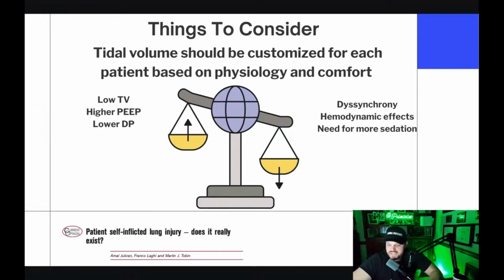Melody always says that, and I agree with the fact that, yeah. So, respirologists, we're going to get to the PRVC. Don't worry, we're going to elucidate that tremendously. I just don't know for me in the hospital how much it's helpful. I can see if you're transporting a patient, it's definitely helpful if you don't have access to an i-STAT for a blood gas. Number one. Number two, if you're transporting a patient, and this is intra-hospital and pre-hospital stuff, not that I'm a pre-hospital guy, but I talk to Melody enough.